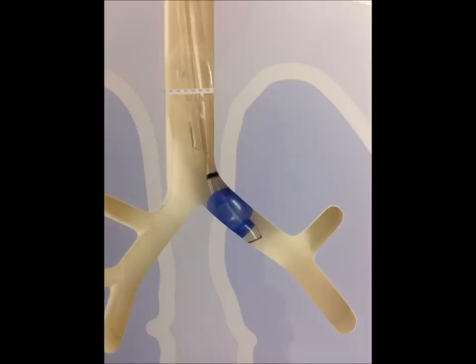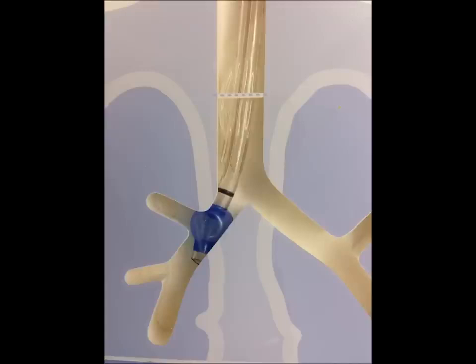In the very rare instances that you're doing a left pneumonectomy where the surgeon's going to cut across here, right before he does so, all you have to do is pull this back just a little bit and let him clamp. It's really very unusual in most facilities to see that big of an operation, but that might be the only time you really want to put a right-sided tube in.